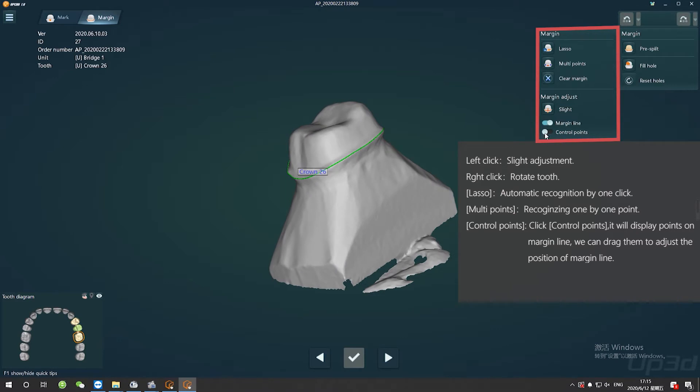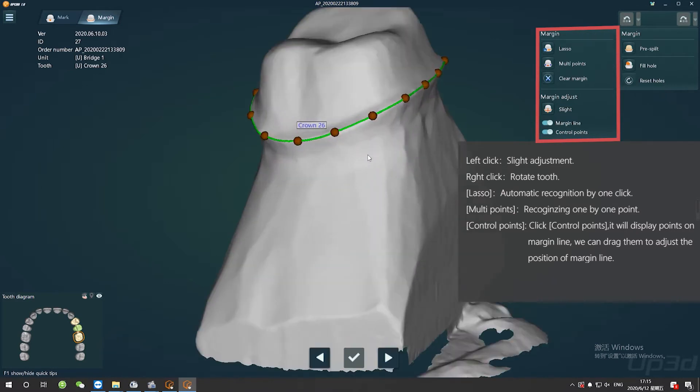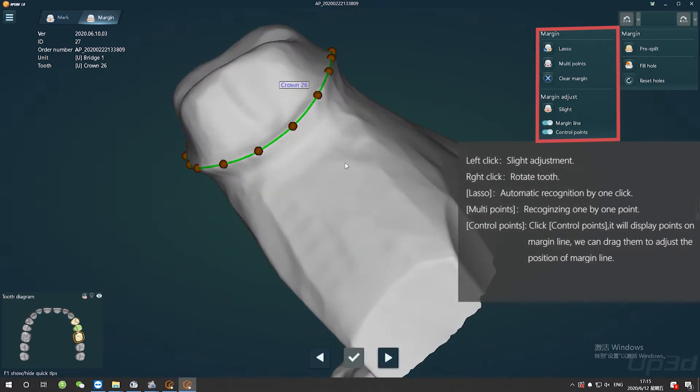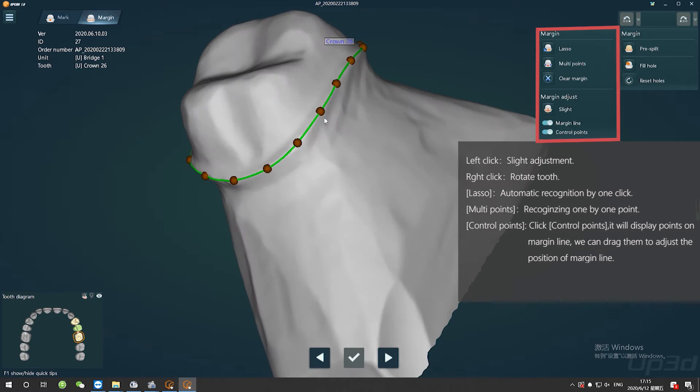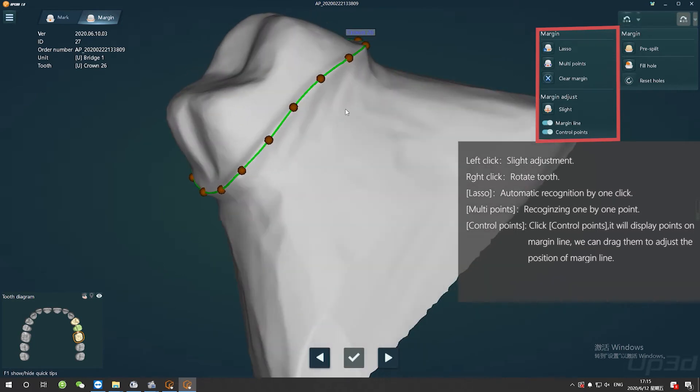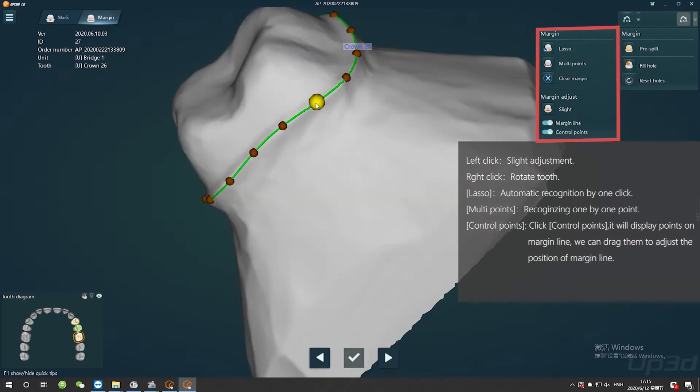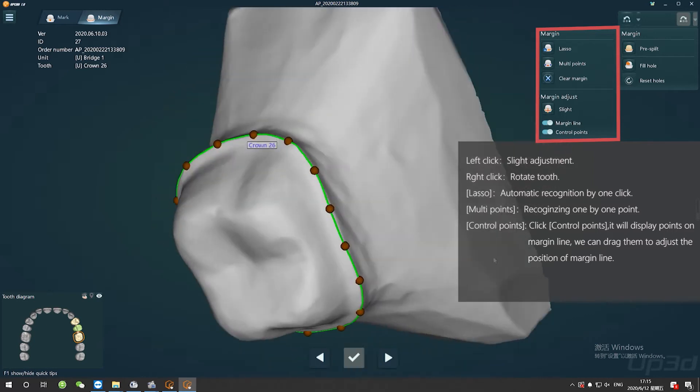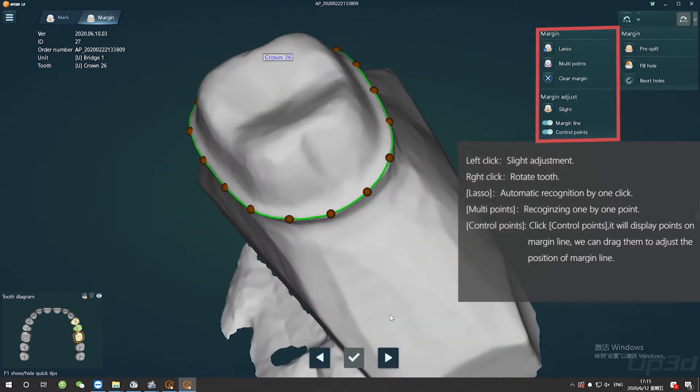If it's not correct margin line, we can look at the right top window. There is a button, Control Points, we click it, and you will see there are many points on the line. And we can drag any points you want.